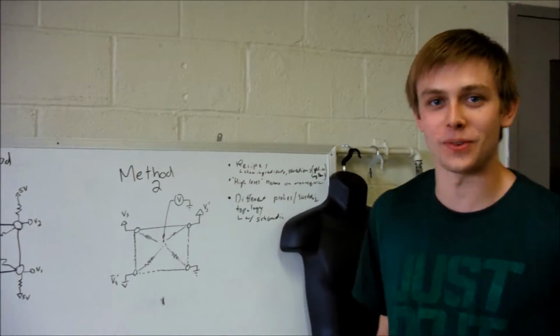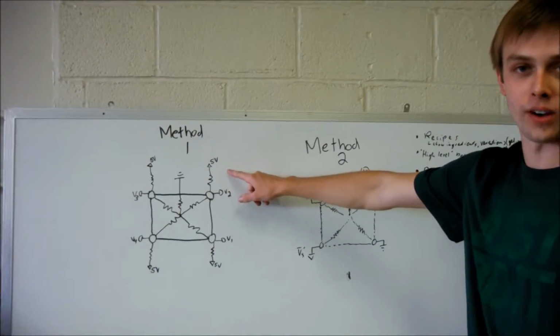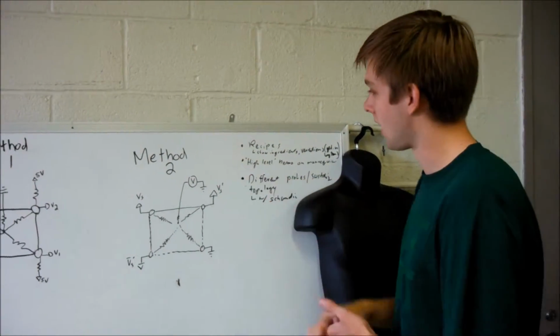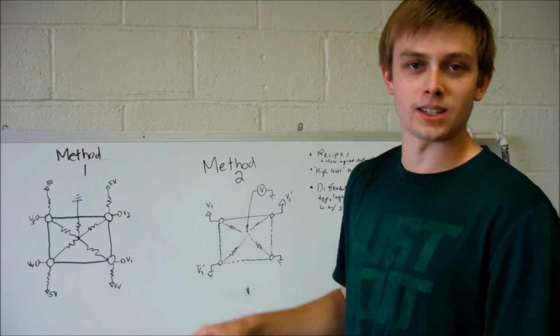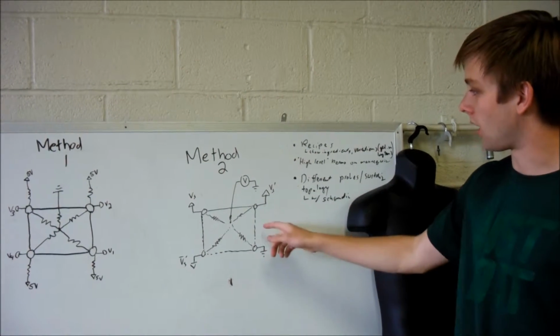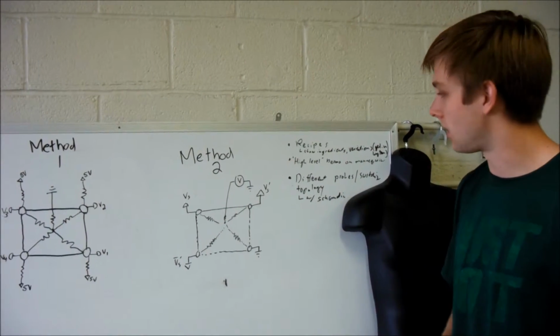So for the 2 different methods that we're using, we're either trying to figure out the resistances by interpolating and doing voltage dividers, or, method 2, we're measuring a strict voltage. The first method has proven to be a little more challenging and less consistent, so we have moved to method 2 as our primary goal to achieve, where we have the resistance built in with the material that we're using.